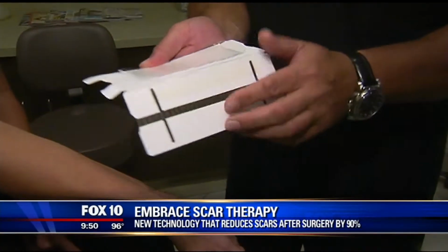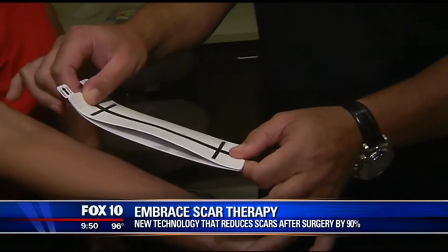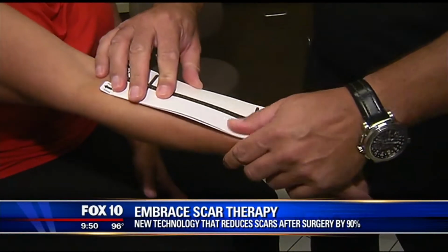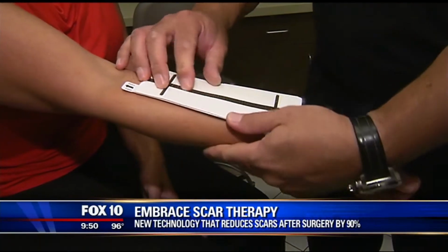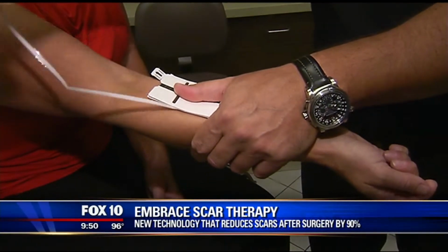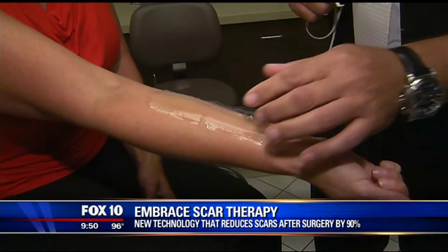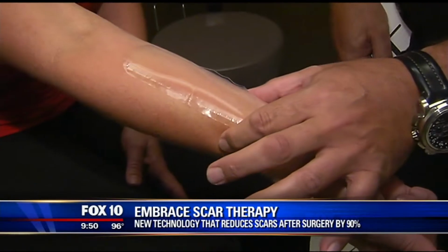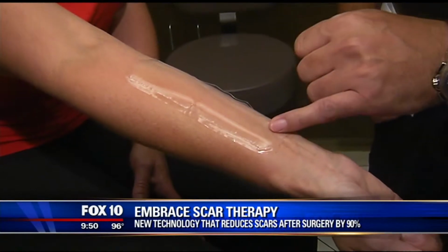You stretch the dressing, and this is really the key to how this works. We've essentially taken a dressing, stretched it out. Let's pretend that Liza has a scar running along this line. I'm essentially releasing the bandage from the backing. This line represents her surgical scar, which of course we're pretending is there now. You pull on these tabs, and this releases the dressing. And when you take this book off, you basically have a scar that has shrunken horizontally, if you can imagine, bringing the tissues closer together and relieving the tension across the makeshift scar that's underneath here.